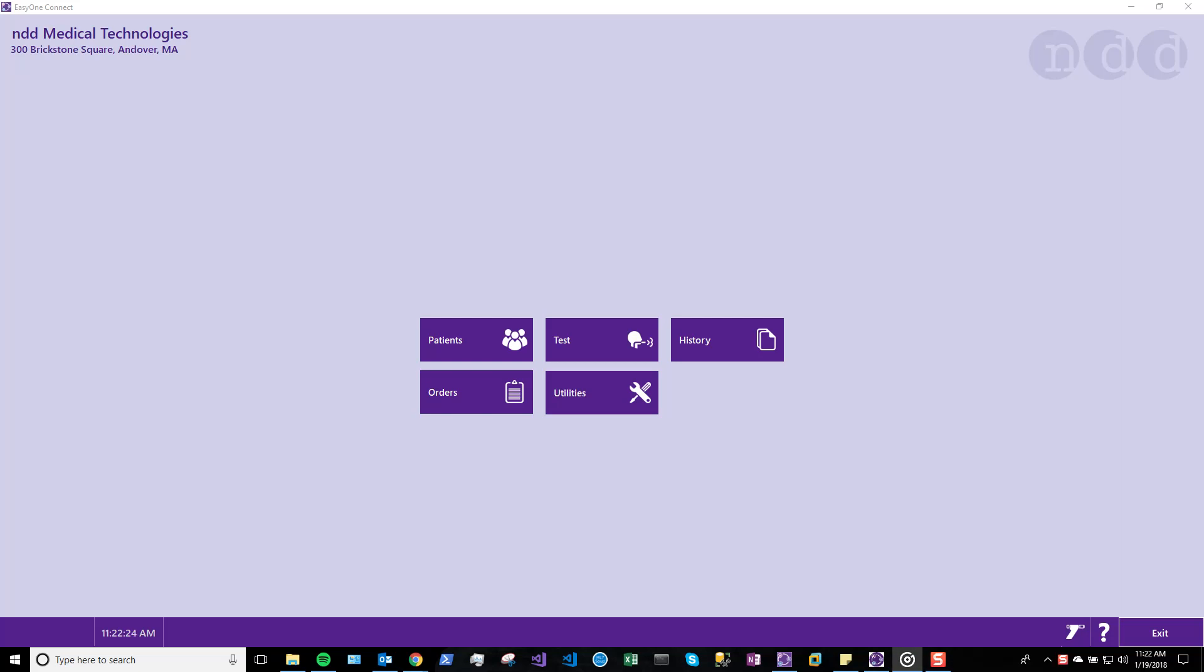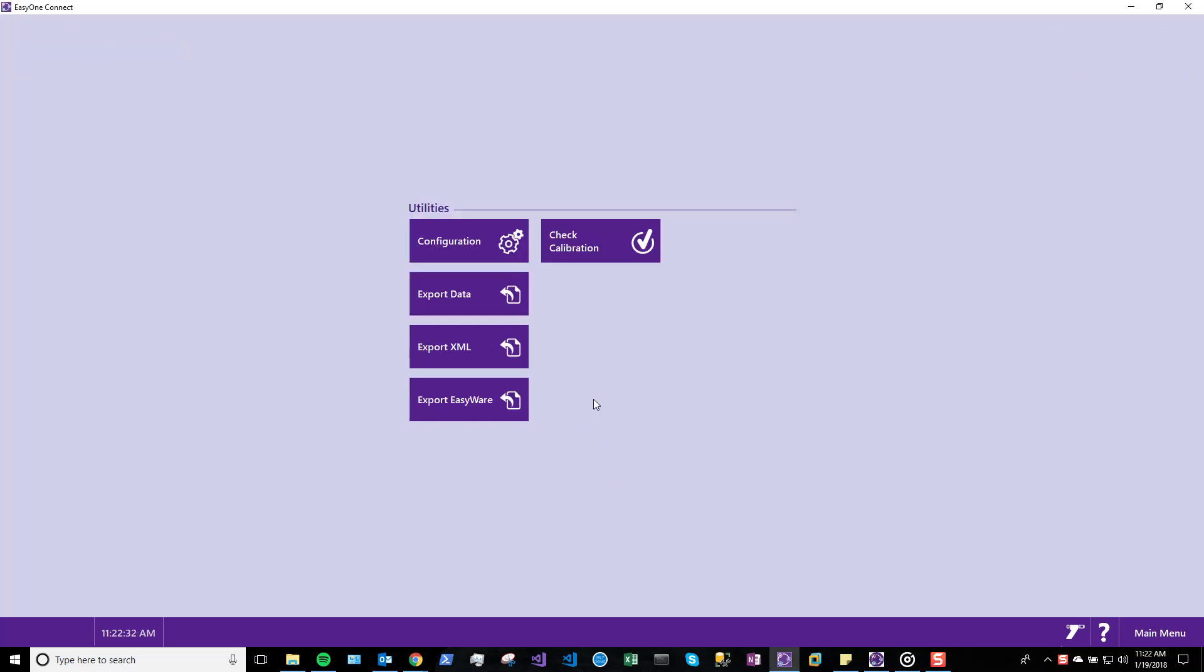Here is a demonstration of how EasyOne Connect interacts with your EMR when using orders. First, select Utilities from the main screen of EasyOne Connect.